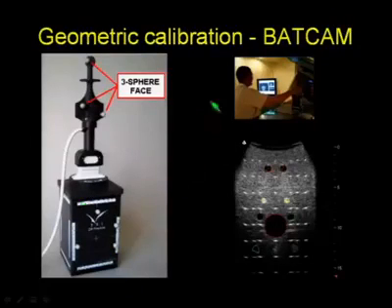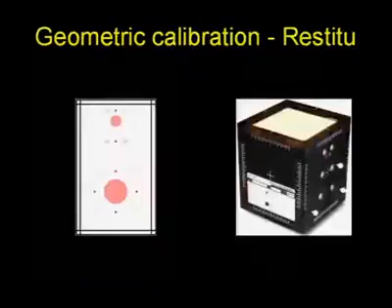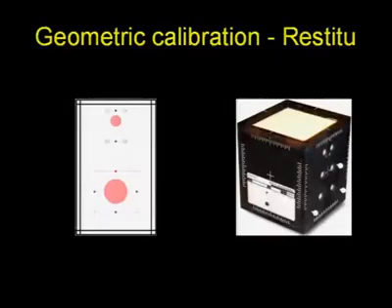phantom, which is used, displaying in this case the probe with the 3 infrared markers that can be used to correlate the position of the probe within the room, and resulting images showing the ultrasound of the day, with superposed on top of it the contours obtained from the reference CT dataset. So this can be performed on a daily basis. This is fast. It takes about a couple of minutes to do. And again, the vendor has come up with their own solution using their own configuration of objects within their own phantom.